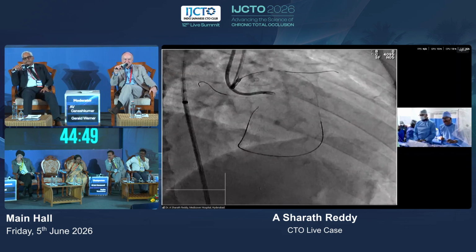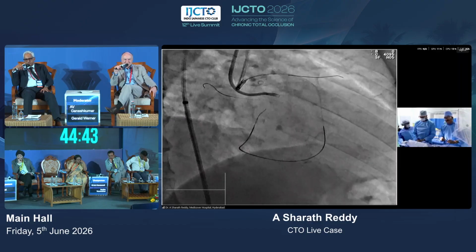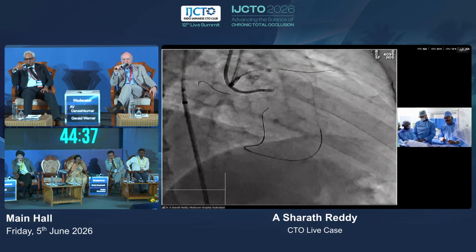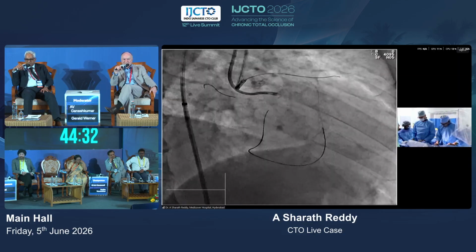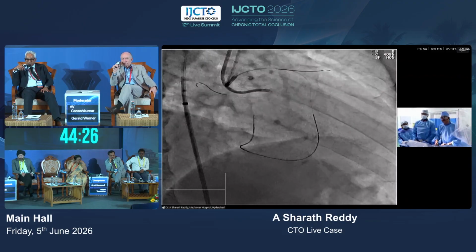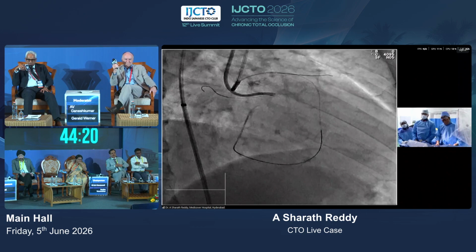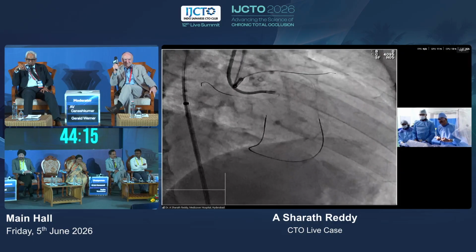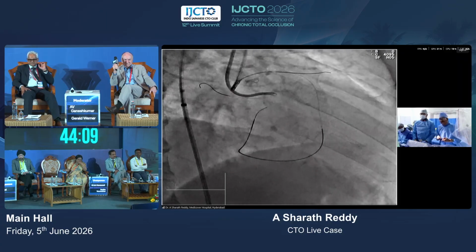Sharath, we feel that the puncture between the antegrade cap versus the distal cap here, both are ambiguous. Yes. In the antegrade cap, at least you have more control, while the retrograde cap, you do not have any control on it. I mean, we don't know where you're going to puncture. So what we strongly believe is that leaving this wire here in the retrograde position, the antegrade puncture would be safer and more predictable. Yes, yes. I take your point.